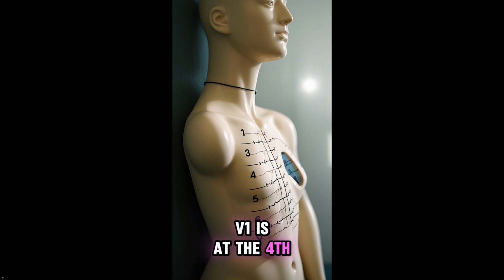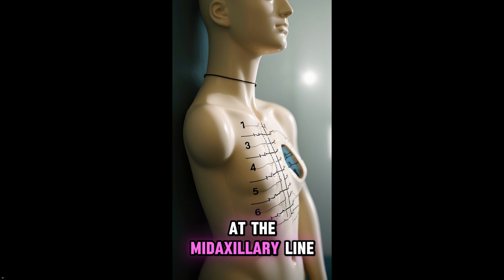The chest leads are V1 to V6 across the precordium. V1 is at the 4th ICS, right sternal border, and V6 is at the mid-axillary line.